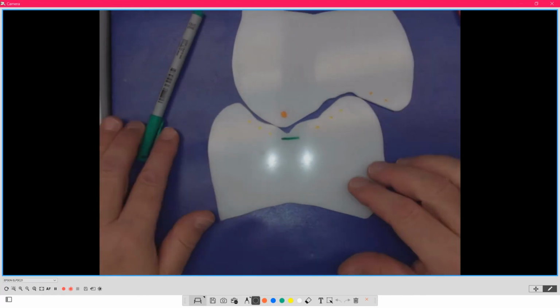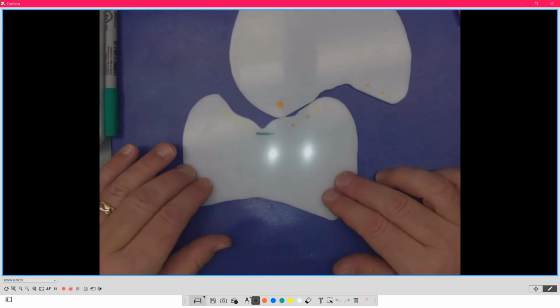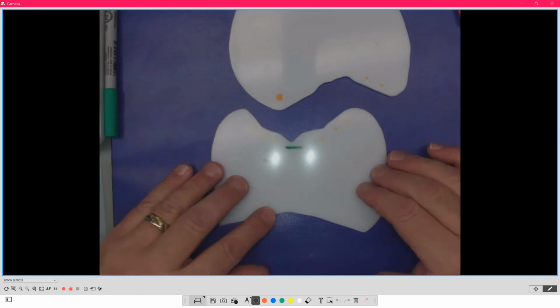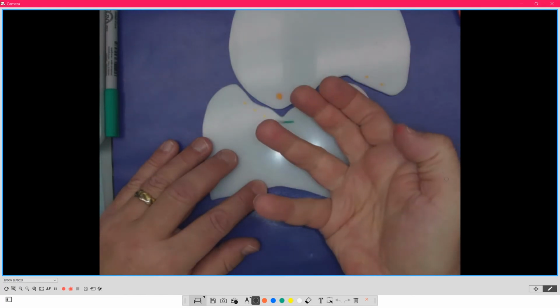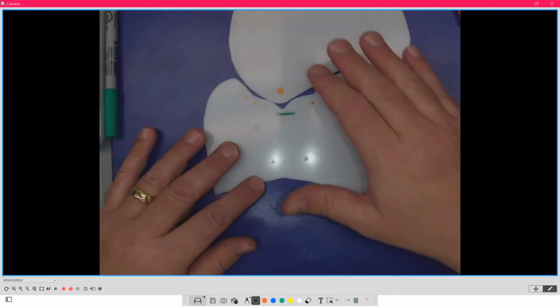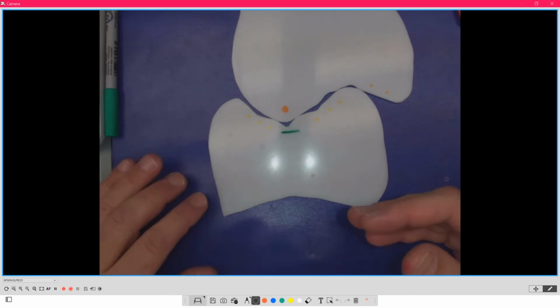So now I'm coming up with a chew cycle. Do they have a more horizontal chew cycle? Then yeah, I'm going to get more opportunity or more chance of a hit and slide. So I can go into the VITA Teeth and adjust the guiding planes to allow this thing to function more horizontally, yet not disturb the main power cusp and the bowl that's holding the food. That way it can function within that patient's chew cycle and have less chance of a hit and slide. Because remember, a hit and slide can be the width of a human hair, but we all know a width of a human hair is like 6 miles in the mouth.